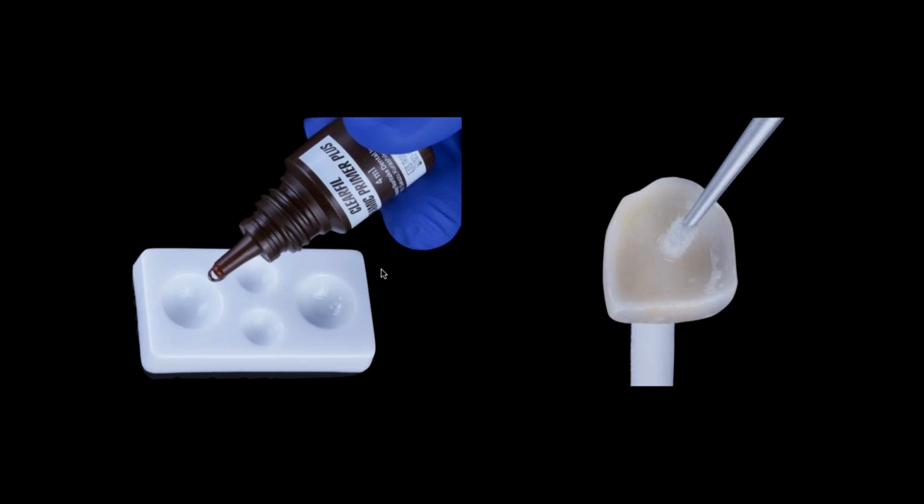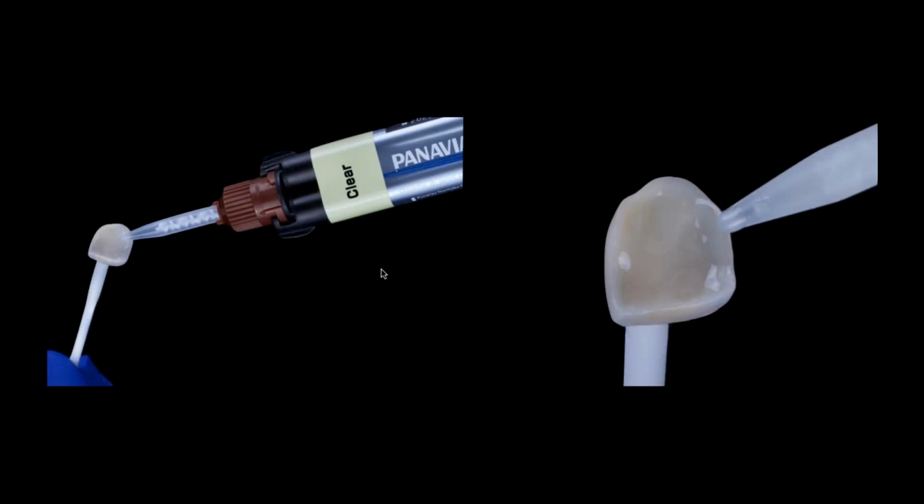As I said before, when I was showing the first case with the porcelain laminate veneers, the feldspathic ceramics, we want to use a rubber dam isolation. We want to work during the time of provisionalization on the hygiene of the patient, prescribing a high percentage of chlorhexidine during 15 days. So that will help us reduce the amount of bleeding that we have, and then we can place the rubber dam and start cementing 2 restorations at a time. That's what we do, starting with the centrals, then going with the laterals, and then going with the canines.